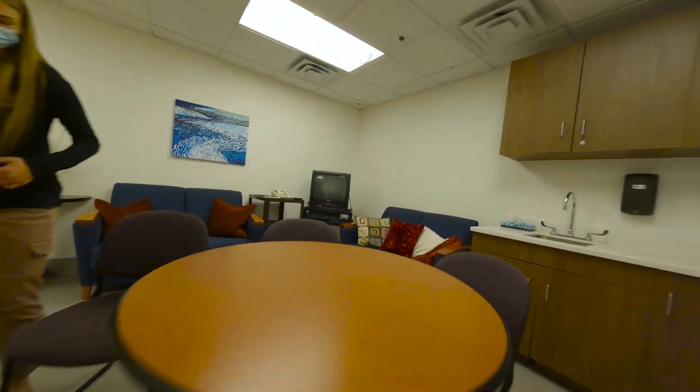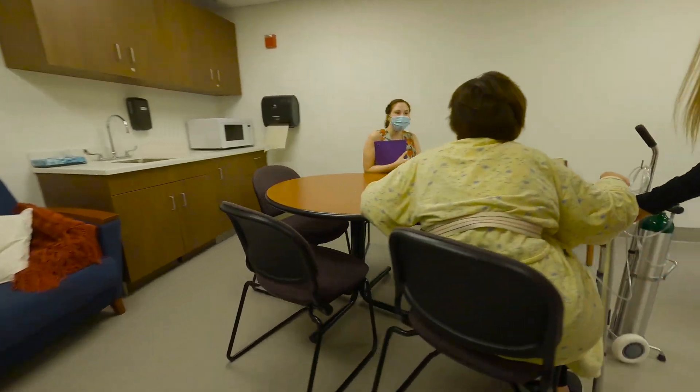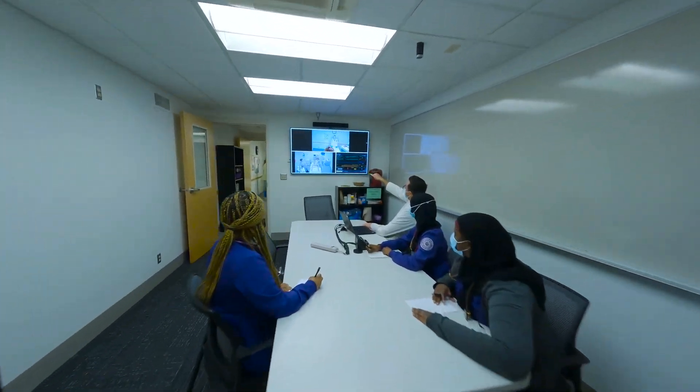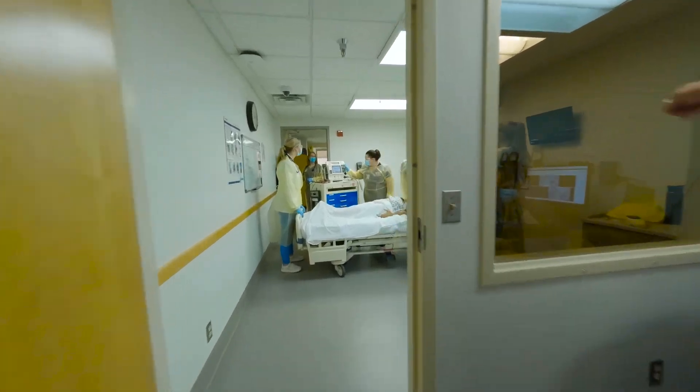How about some breakfast? I can do this myself. Good morning. I'm the dietician and I'm here to do a nutrition assessment. Where's your breakfast? How does your bag-valve mask technique look? It's full of glue.